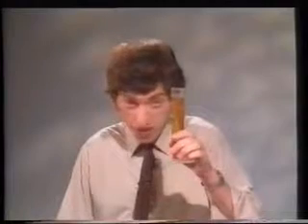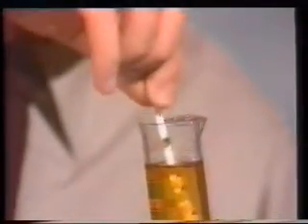You take the urine in the clean, dry container, and you take the dipstick. Now, what you're going to do is immerse the dipstick into the urine so that all the reagent pads, every single one of them, is covered by the urine, and immerse just for 1 or 2 seconds only, just like that. Straight in, all the pads covered, 1 or 2 seconds out.